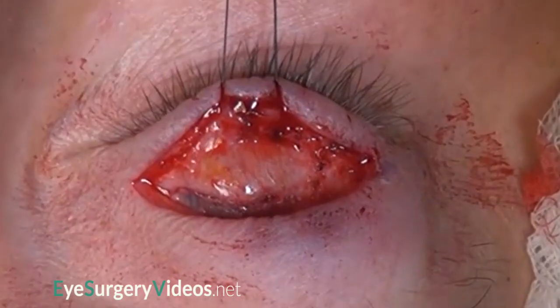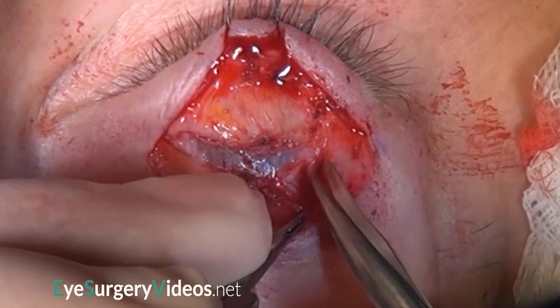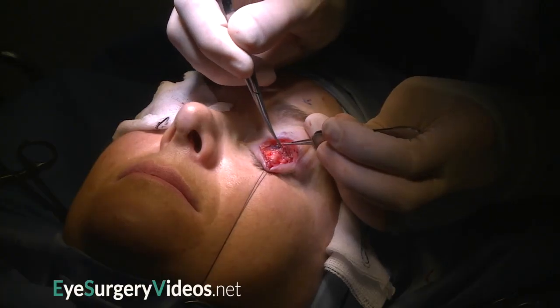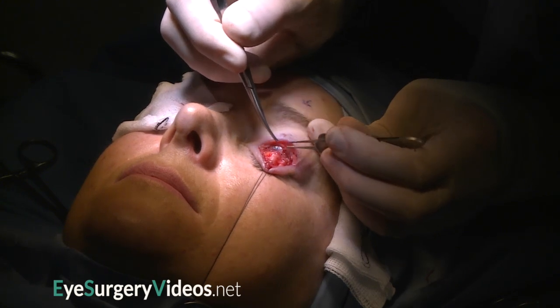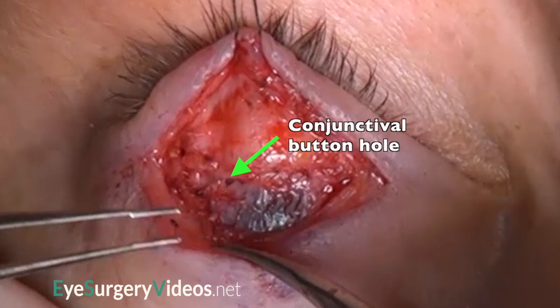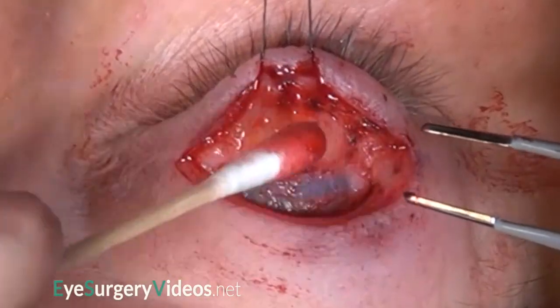The inferior end of Muller's muscle is dissected off conjunctiva, and the cornea can be seen through the almost transparent conjunctiva. The lid lowering is achieved by the titrated dissection of Muller's muscle off the underlying conjunctiva. A small conjunctival buttonhole has been inadvertently created, which is not problematic.